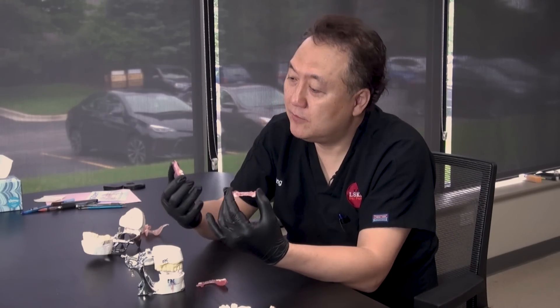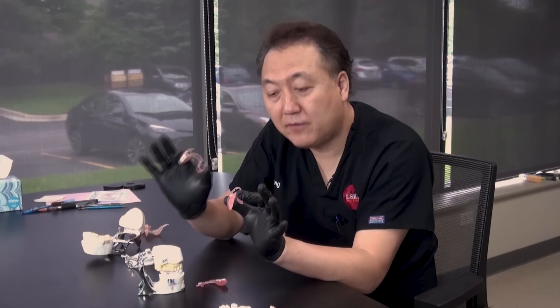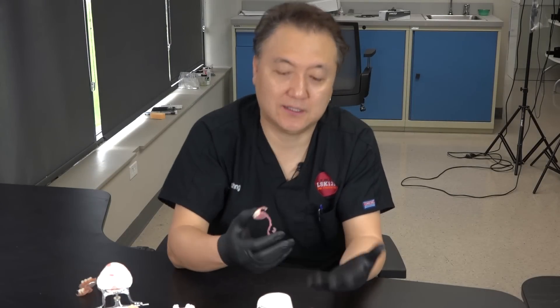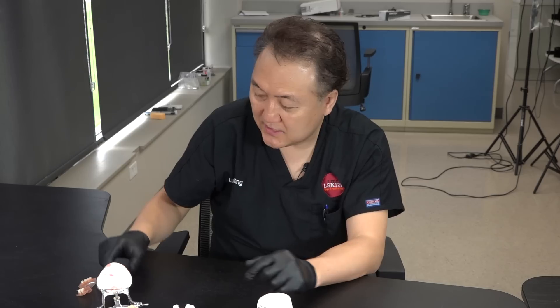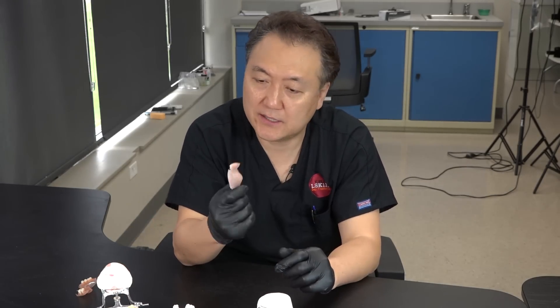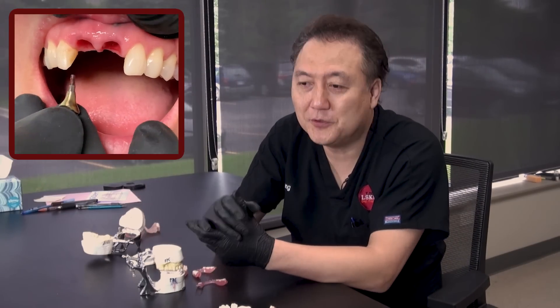Today I brought a flexible partial, which is a very exciting moment. I would like to show you why I'm excited regarding the partial, which is the most inexpensive prosthetic. So during the times we lose a tooth — maybe 20 years old, maybe they're fighting, they're losing the tooth, they broke the tooth playing hockey. They broke teeth number 8 and 9.